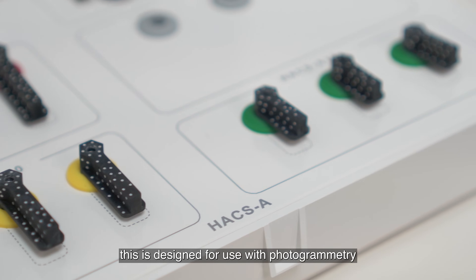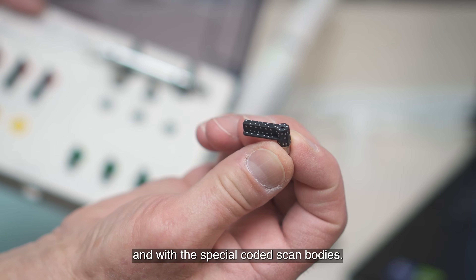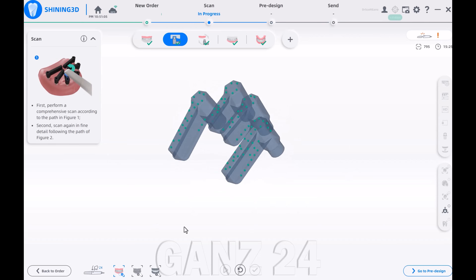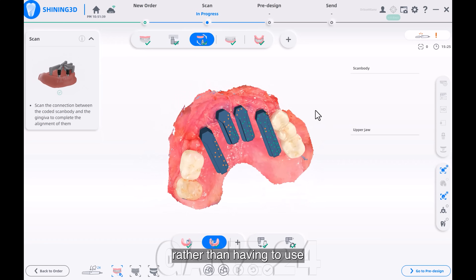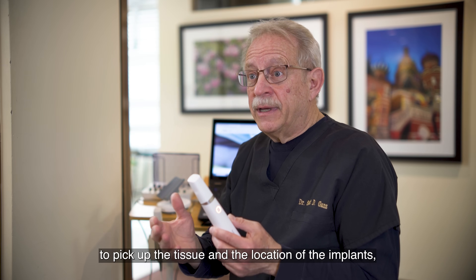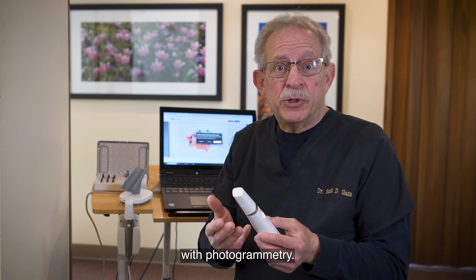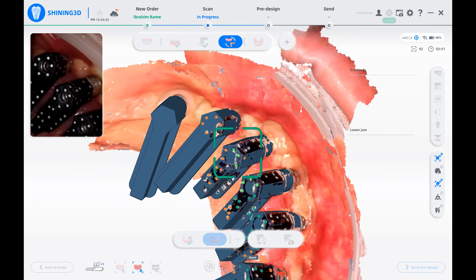It's truly amazing in its ability to record what's in the mouth — both the soft tissue and the metal abutments. But specifically, this device is designed for use with photogrammetry. With the special coated scan box, it truly picks up the location of the implants with extreme accuracy. Previously you would need a separate intraoral scanner for tissue and implant location, and then a separate device for photogrammetry — but with Shining 3D's protocols and workflow, we don't have to do that.